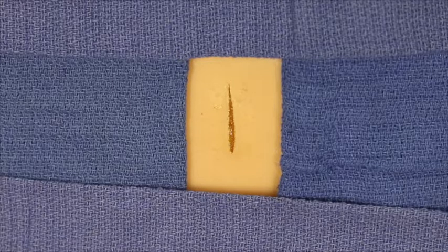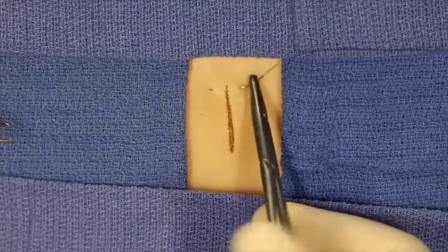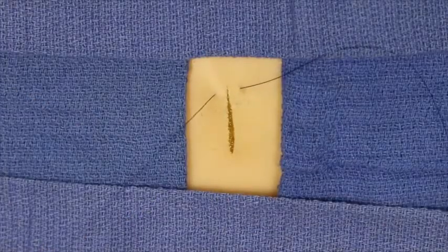The running horizontal mattress suture is placed by first tying an anchoring suture at one pole of the wound and gently tying that off.